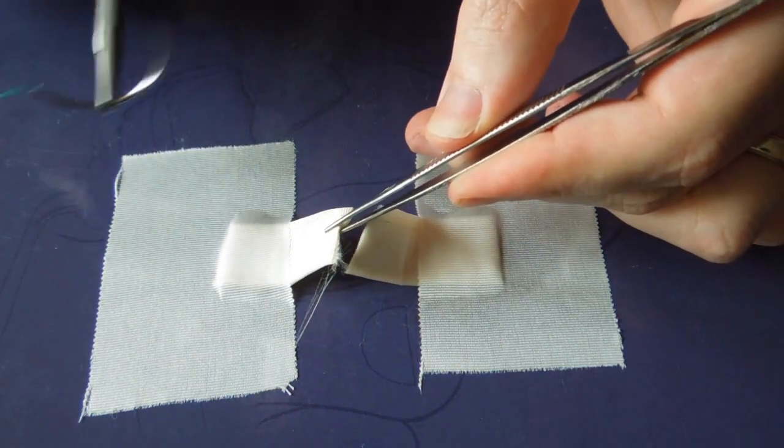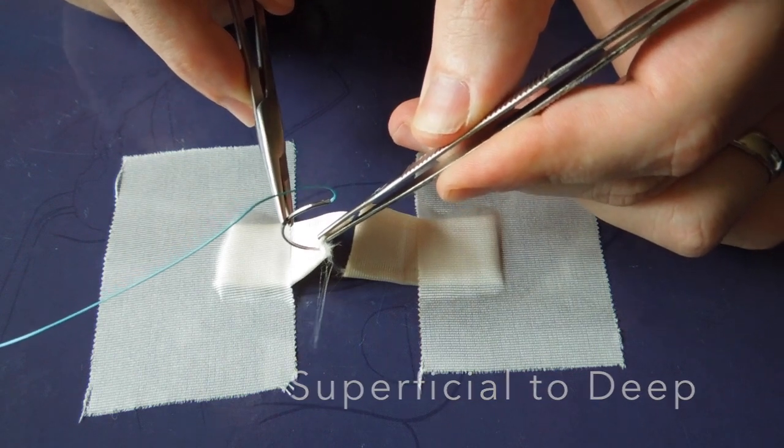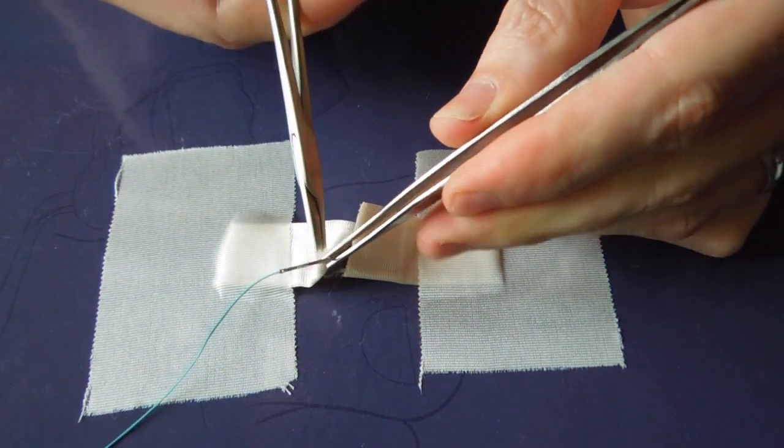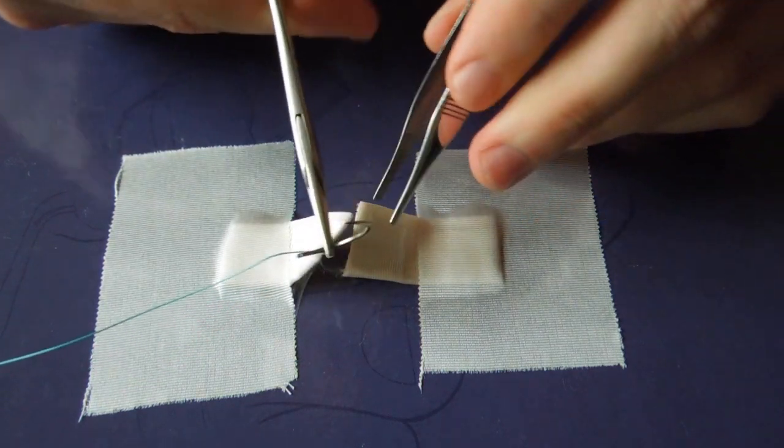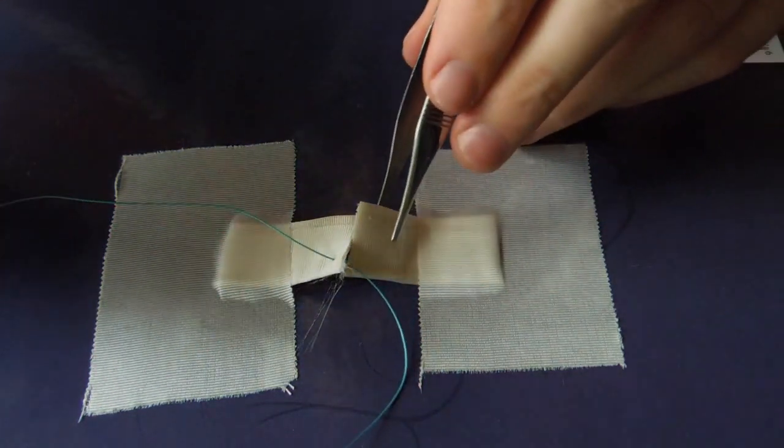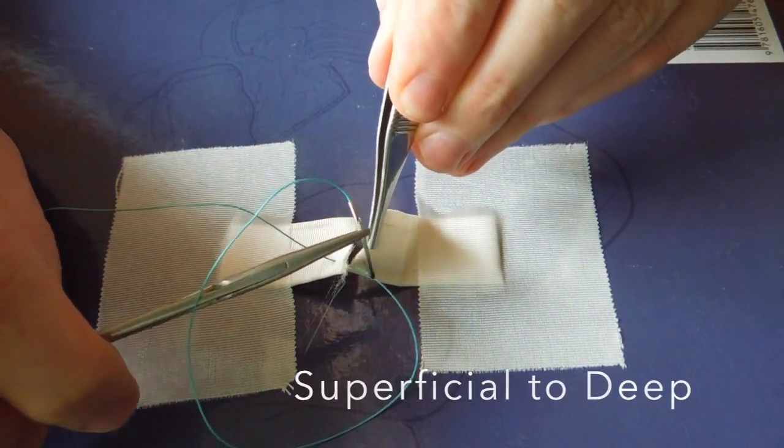So what we do first is we section our ligament, and then we're going to throw four throws here. The first one is superficial to deep on side A. Then moving to side B, we're going to throw the same direction, superficial to deep, and that's on side B.